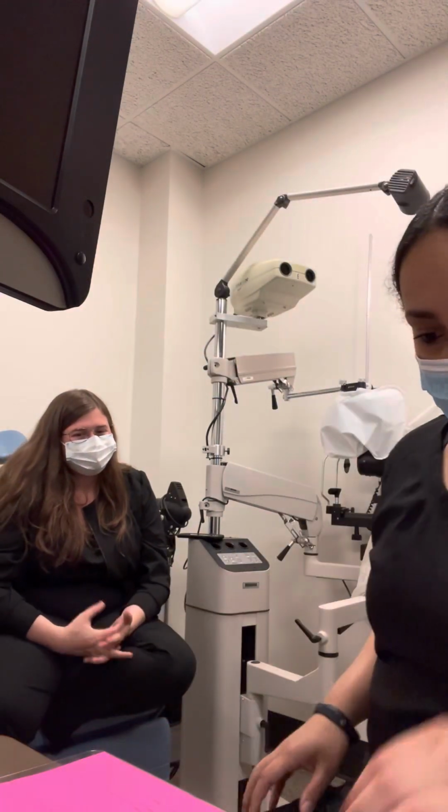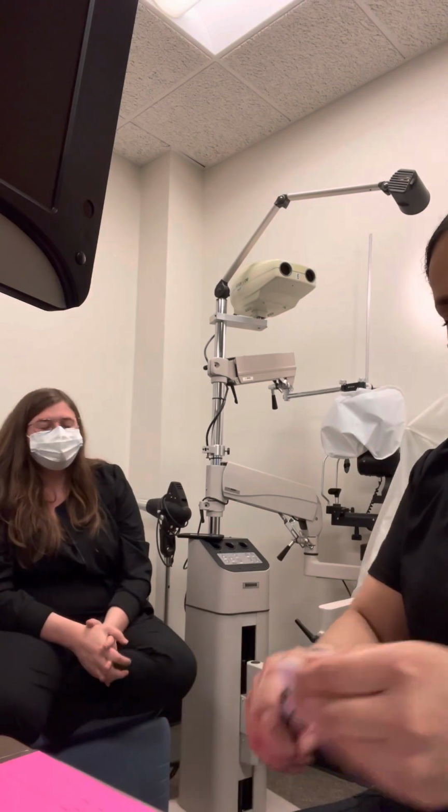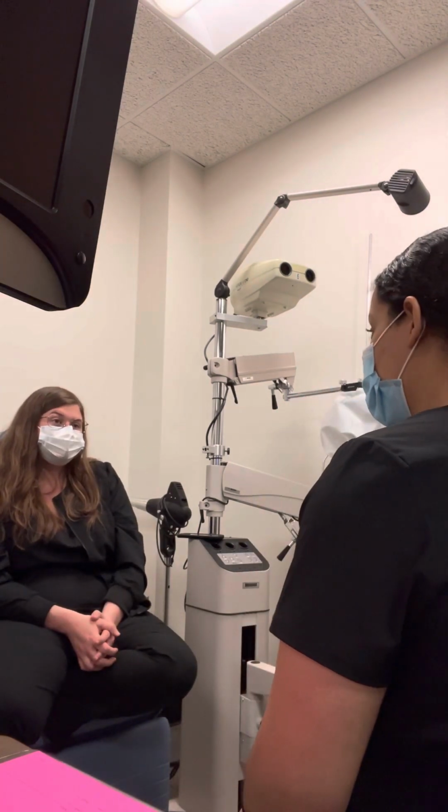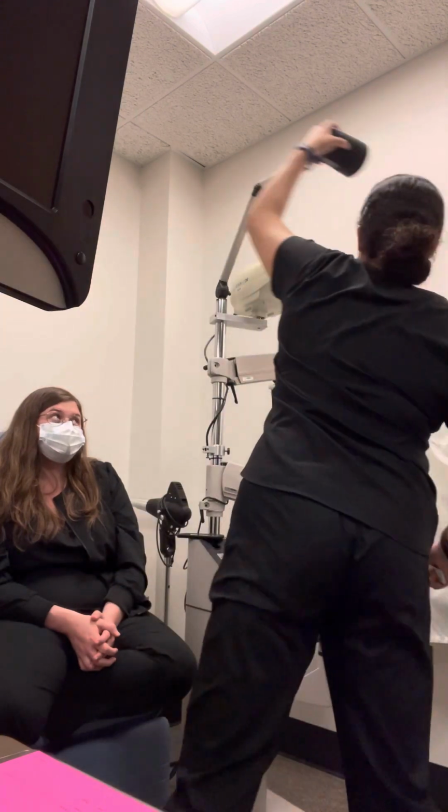Alrighty, Miss Barber. So next we're going to just check how well your eyes adjust to something up close and how well you adjust to something far. Go ahead and open. I'm going to have you look over here.